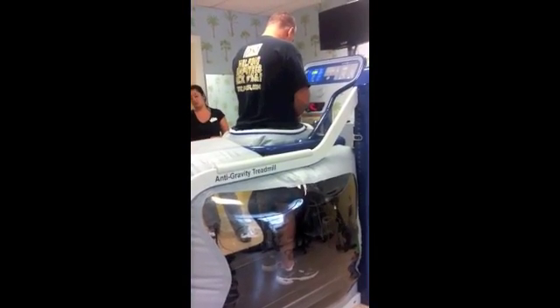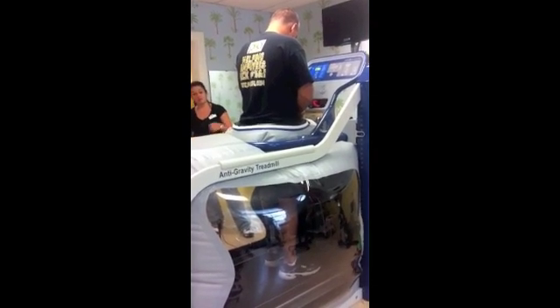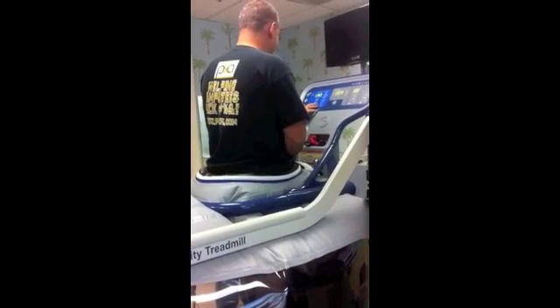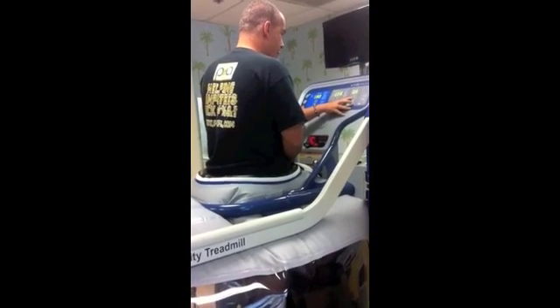Then air was pumped in and the treadmill was programmed to let Mabio walk at 70% of his 194-pound body weight, and then down to 50%, so that his legs were effectively supporting a 97-pound man.